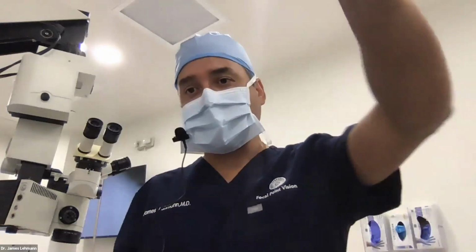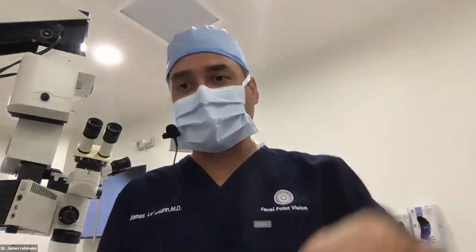Dr. Sharma asked, do you practice horizontal and vertical chopping? Normally, I only do divide and conquer, but in soft nuclei, I can chop the last heminucleus, but I don't really do stop and chop because I've never been comfortable with putting instruments blindly behind the iris.